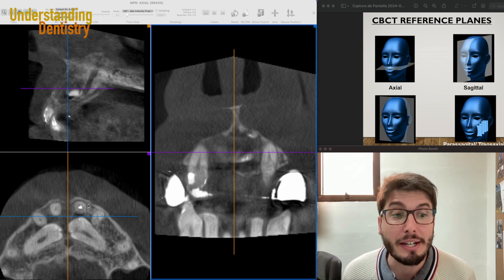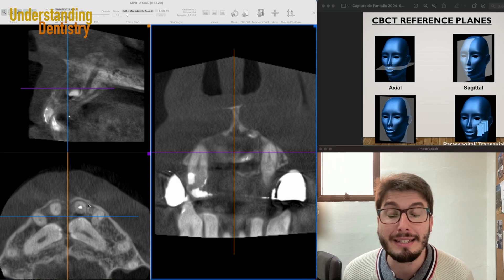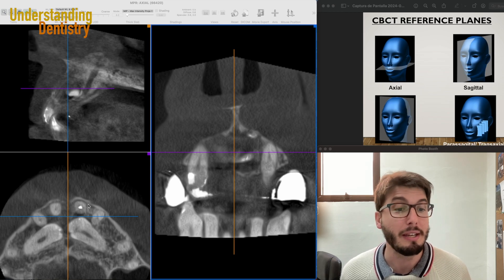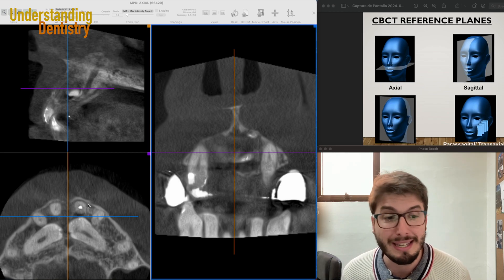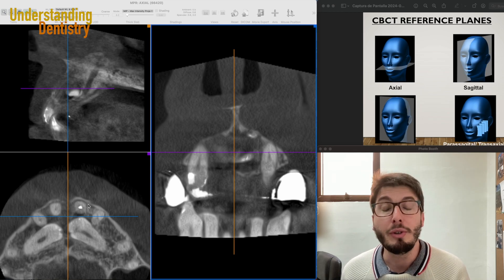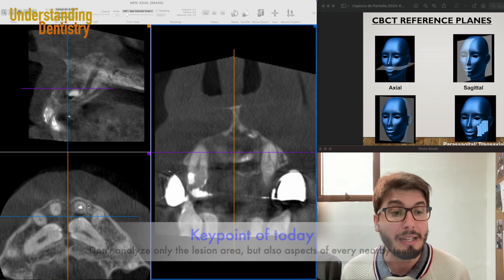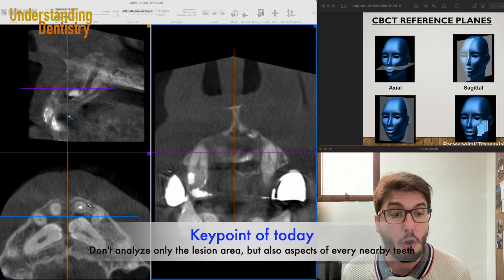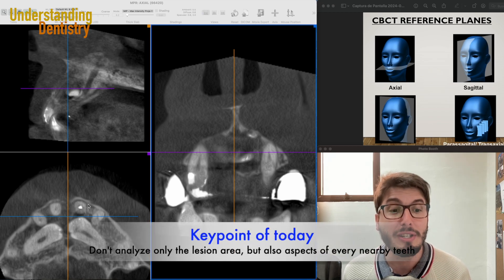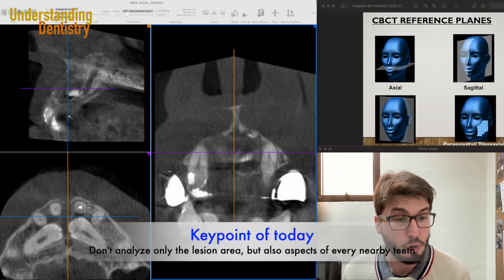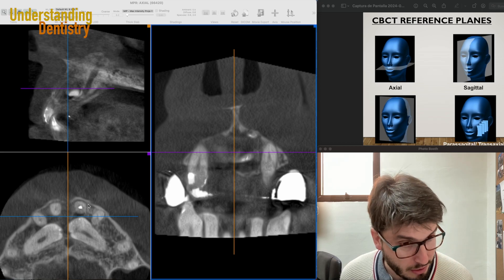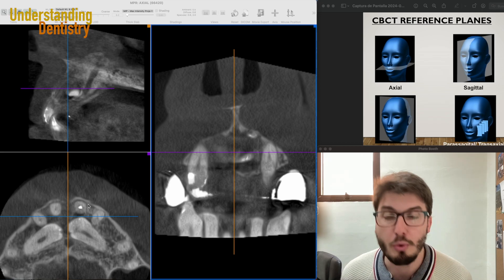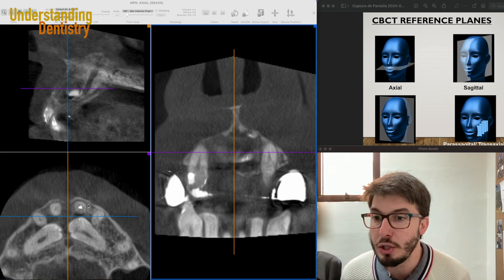And here comes the best tip of today: don't analyze only the lesion, but also every single tooth in continuation with the lesion. We are going to do this together.